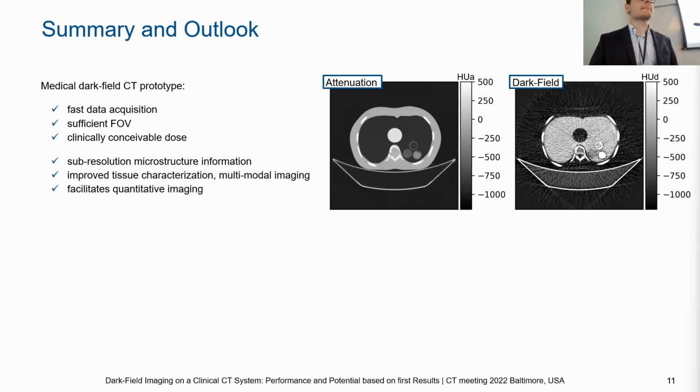Okay. Now, a quick follow-up question to Bruno's question. Regarding kV, at least for clinical CT scanners, for chest imaging, we have challenge areas like the shoulder area, the top of the lung, where you have a lot of attenuation in the lateral direction. So clinically, even 80 kV will be very challenging for large patients. We probably scan at 120 kV, and even then for obese patients you might still see streak artifacts. I'm curious whether in dark field you have similar challenges, needing to go to higher kV to ensure penetration in the shoulder area.